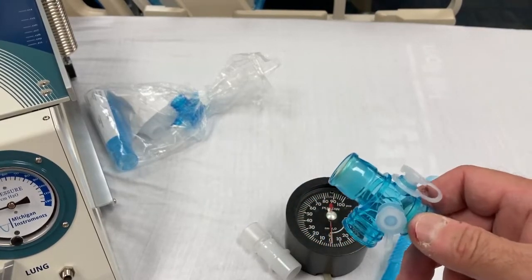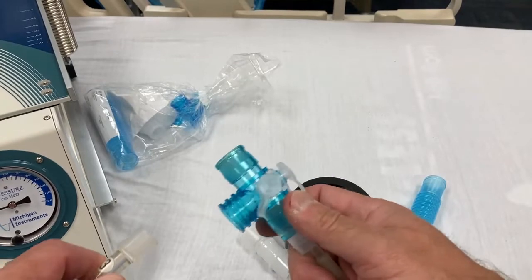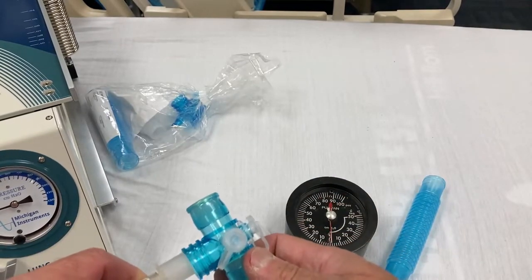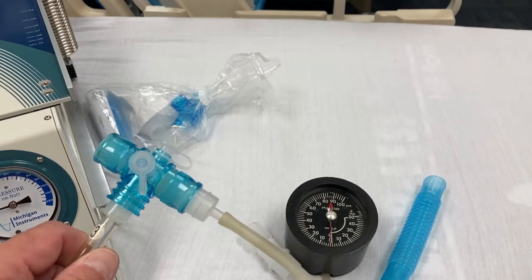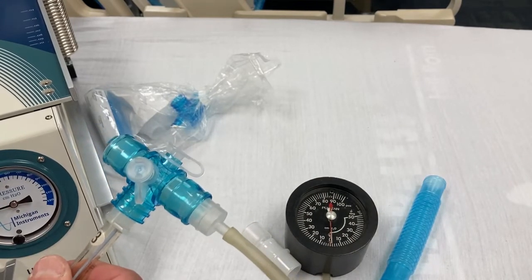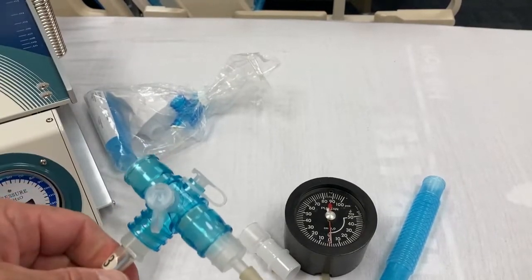Now, technically, the procedure is supposed to last 20 seconds. I don't ever do it that long. I think that's a really long time to deprive somebody of a breath, but there we go. So we just hook that up, and we say, okay, breathe in as hard as you can, go, go, go, go, go, and you watch the needle go down.